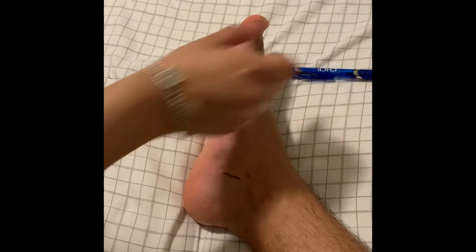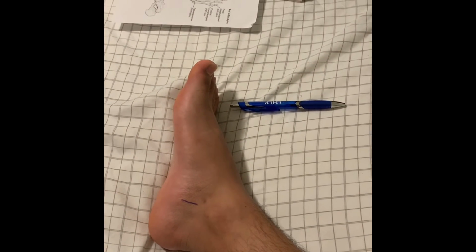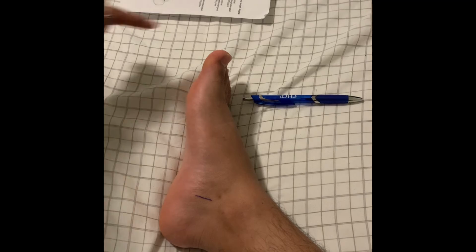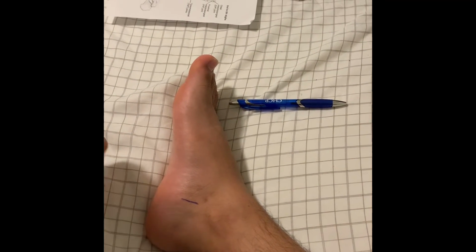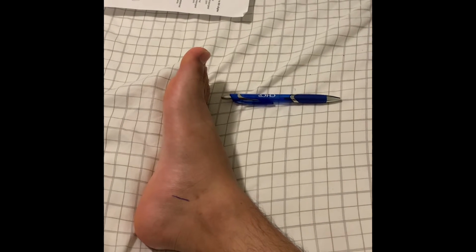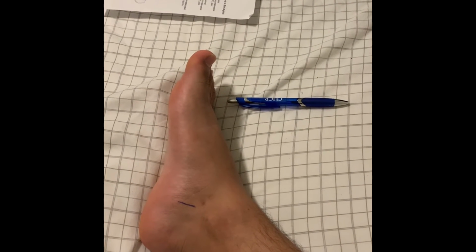Now we put our marker here. And you want to make sure that the collimation is long enough so that the toes and the heel are in the picture, or else you're going to have to retake it. You do not want that for your patient. So now I'm going to step back and take the picture of the foot.